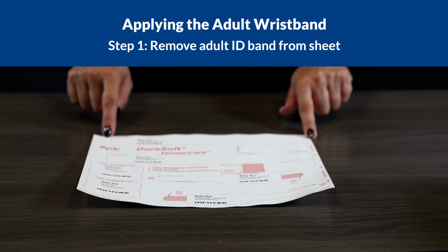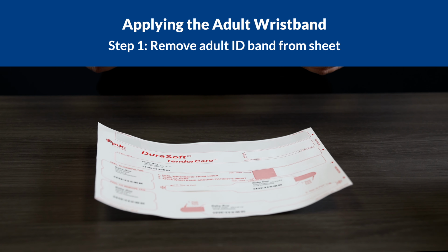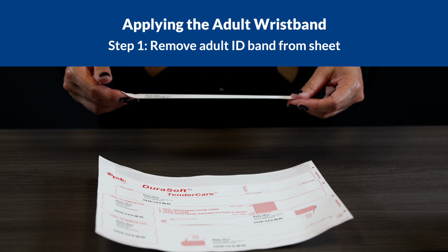Pull to the other end of the band, then apply pressure and tear the band off the sheet at the perforation. Apply the band to the patient's wrist. Be sure to leave a 2-finger space to ensure comfort and a secure fit.